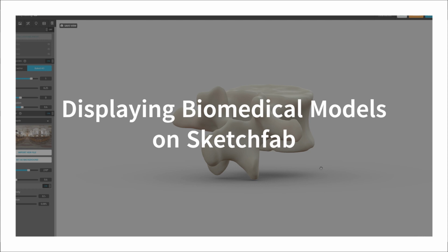So why biomedical models and what does that refer to? Biomedical models would be anything that comes from biomedical imaging like CT scans, MRI, cone beams, microCT, and this can be human or veterinary. And why those types of models? Mostly because you don't have the actual color of the bones or the organs or whatever it is that's been imaged in that type of imaging.